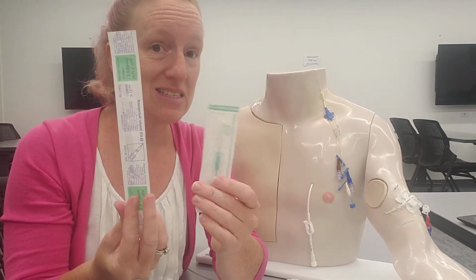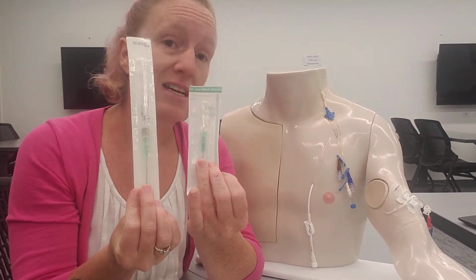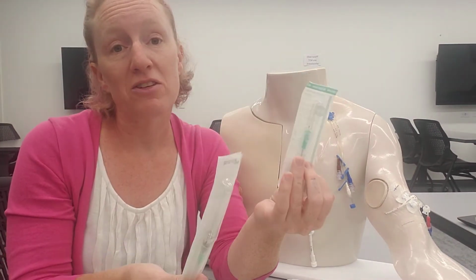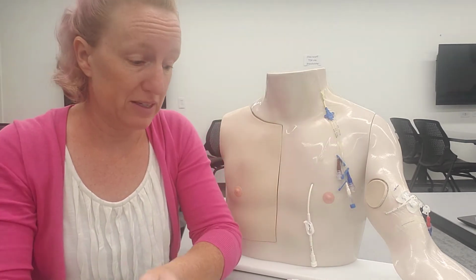You can see in this, these are both 18s. They're both green, but they look different in their different sizes. It's just whoever makes them. So you have to really get used to whatever facility has, because they're all different depending on the brand and the make. So we've talked about peripheral IVs, most common, most often seen. They're usually only good for about 3 days, so they're not going to be our long-term thing.